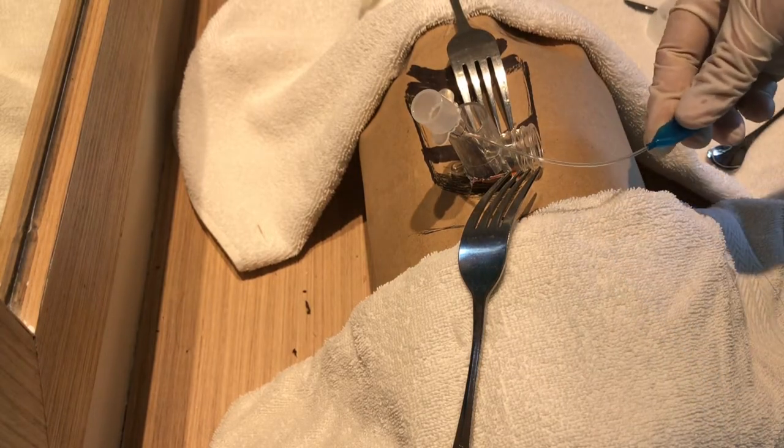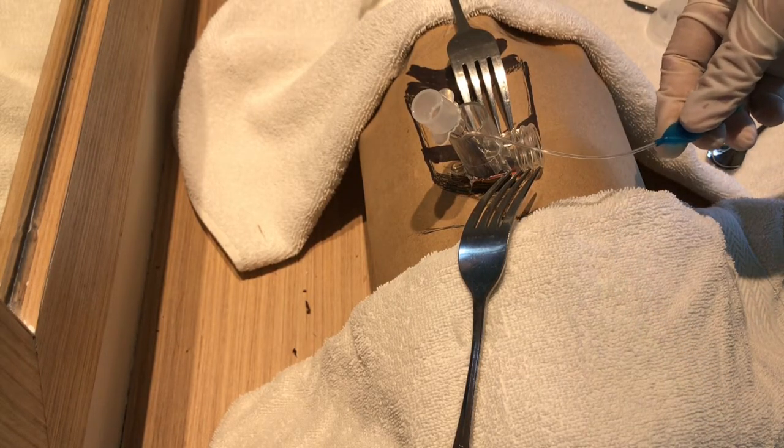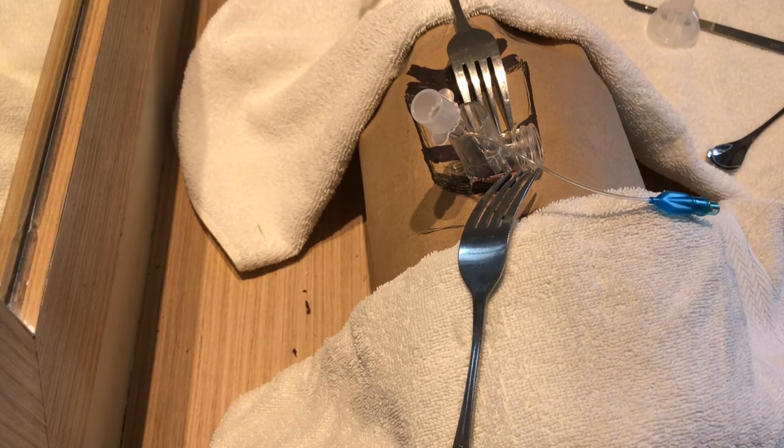Then inflate the cuff attached to the anesthetic tubing. Hand ventilate while correct placement of the tube within the trachea is confirmed by checking the expired PCO2 and checking for chest movement or listening for breath sounds.